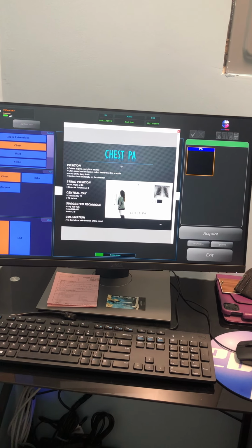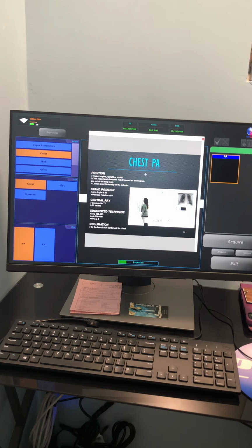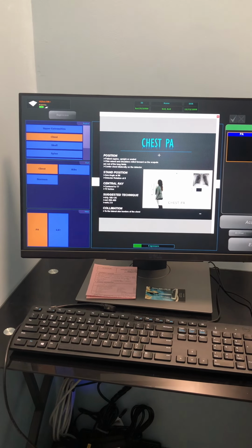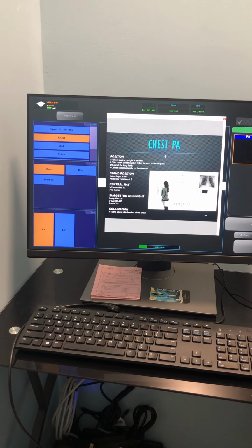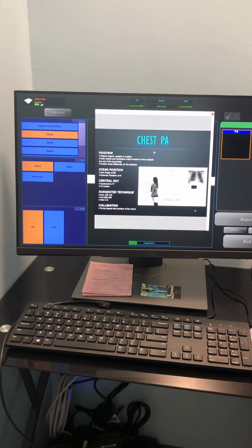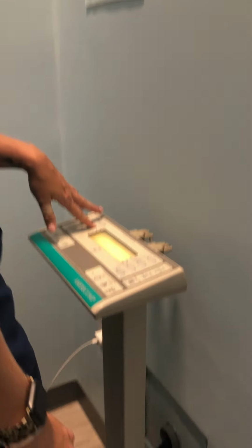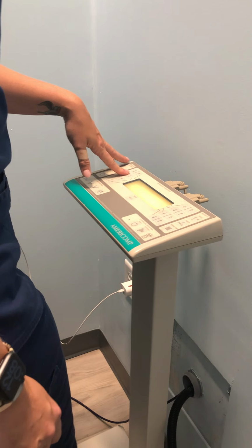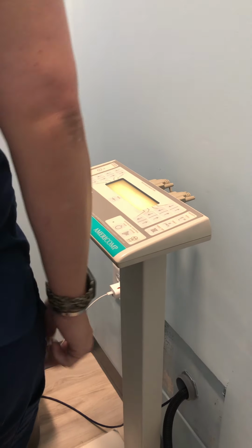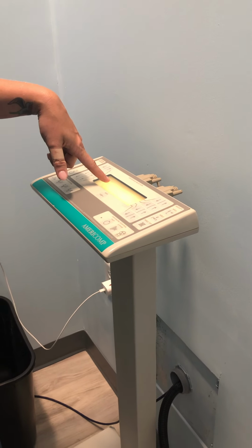Here we go. So chest is going to be KVP is 100 to 125. Our patient's pretty tiny. And then MA is 200 to 400. So that's the bottom MAs. And then the other one is 2 to 8. So now our settings. There is no 8, so 7.5, sure. Right, okay. So again, that's our speed and that's our KVP.